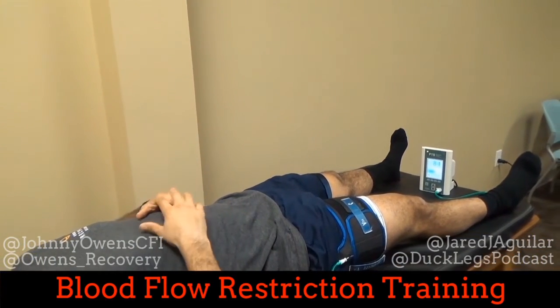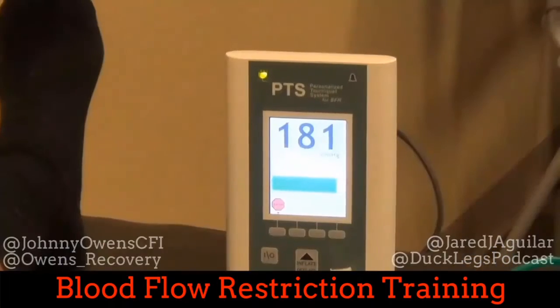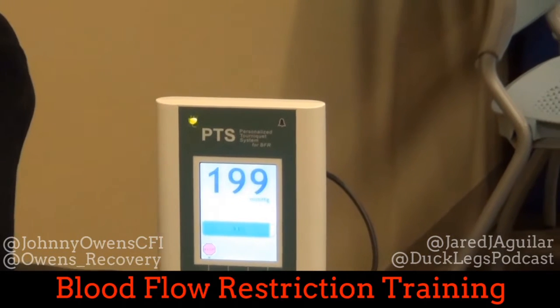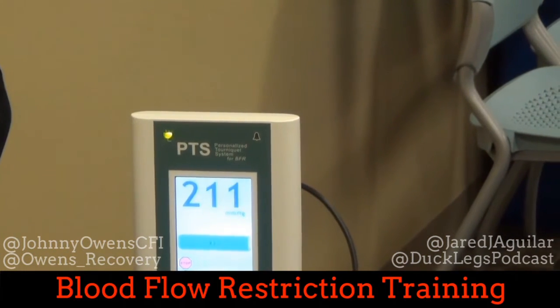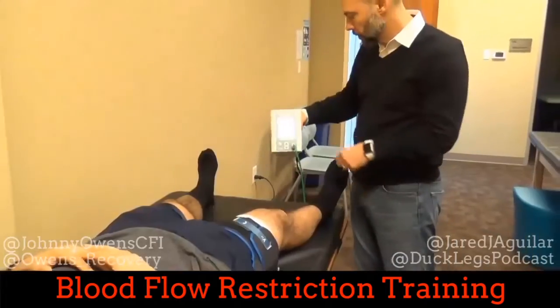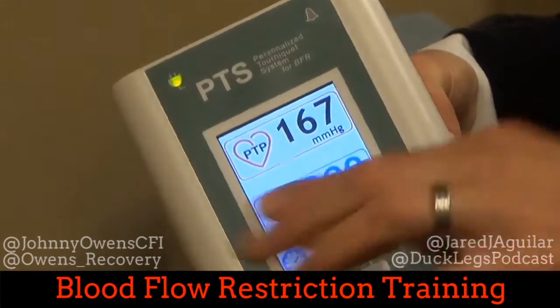Trying to be still and quiet — you're as bad as my patients. The bigger the leg, the longer the Doppler takes. You've got a pretty big quad. We have a 44-inch cuff for our NFL linemen — it's giant. So 209 millimeters of mercury was how much pressure it took to make all your blood flow stop.